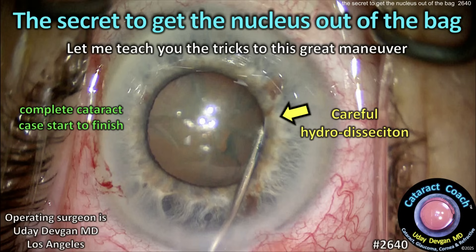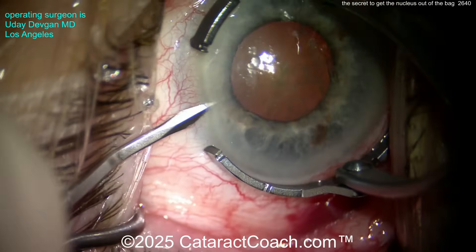CataractCoach.com — the secret to get the nucleus out of the capsular bag. Let me teach you these tricks to get this great maneuver into your toolbox so you can enjoy using it in cases like this.